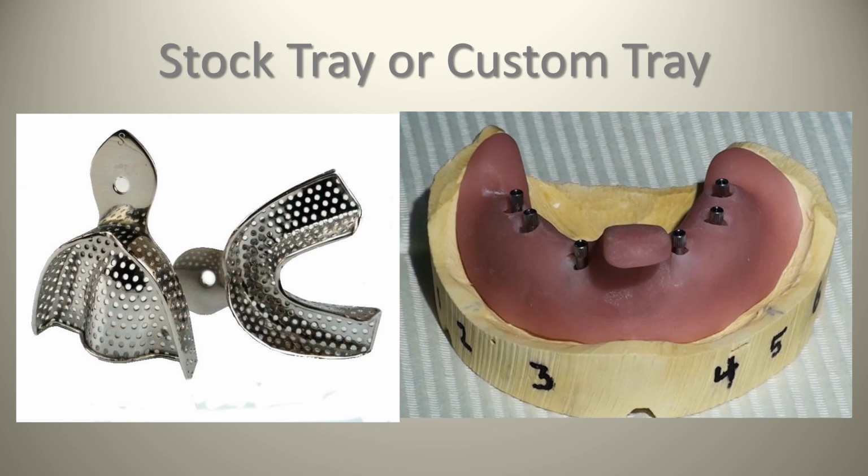So if you don't get your impression material for free, like a colleague of mine, Dr. Mike Tala, who works in Gladwell Laboratories, he's always joking around that he gets his impression material for free from his lab, so he always uses stock trays. But if you don't get your impression material for free like him, you might want to try using a custom tray. Obviously, there's a cost and time in terms of making these things. So if you factor all that in, sometimes it all adds up.